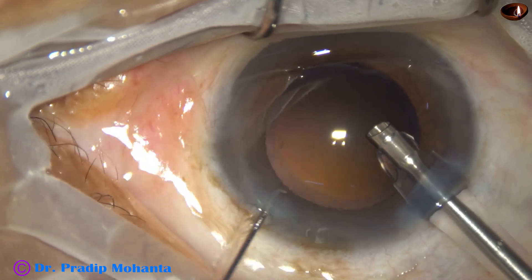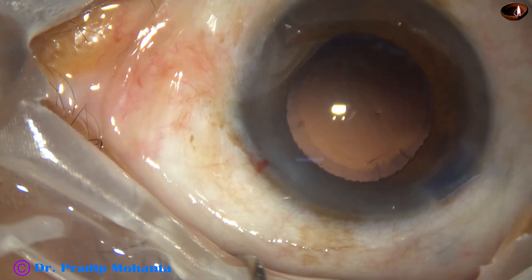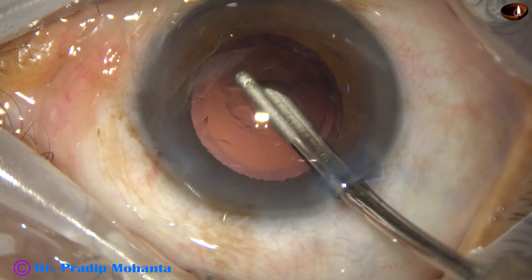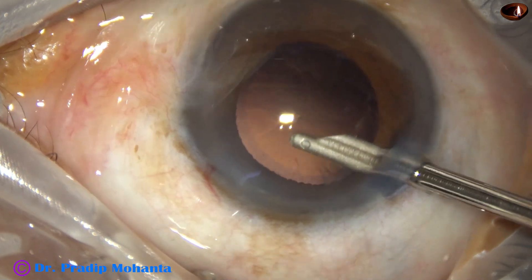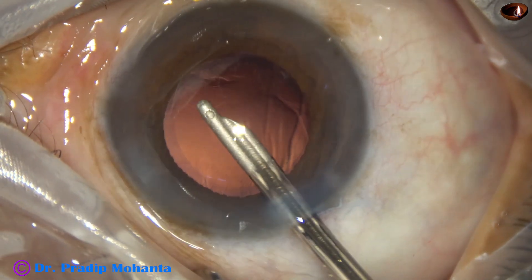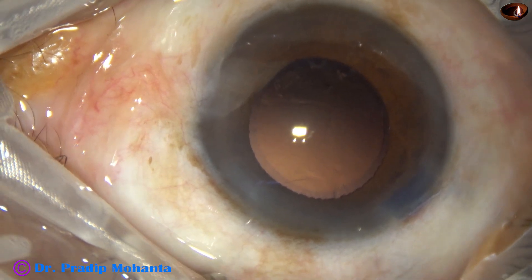Most of the cortex has also come out in this case, but still some cortical lens matter is remaining here and there. The pupil is mid-dilated and there can be some cortical lens matter. I am using a 23G Simcoe cannula to find cortical lens matter — yes, I have got some at one o'clock and some at five o'clock. All the cortical lens matter is removed. I find that the Simcoe is a very benign and very safe instrument; control is in our hands.